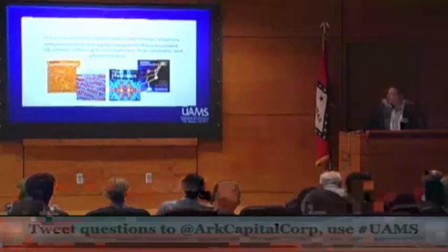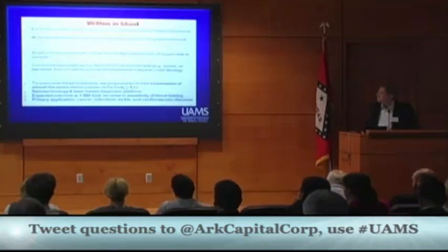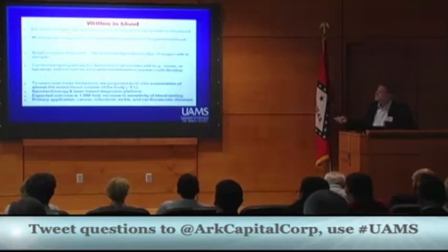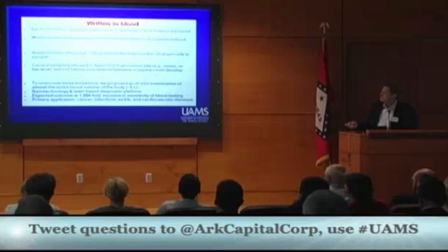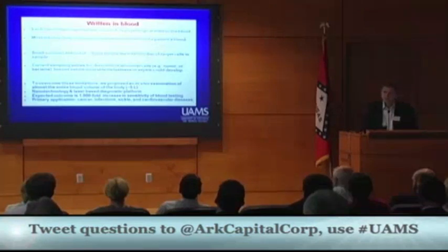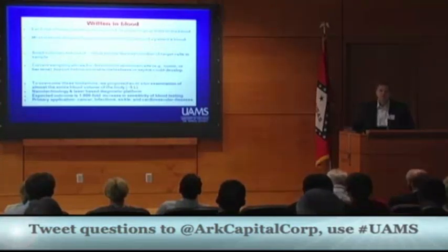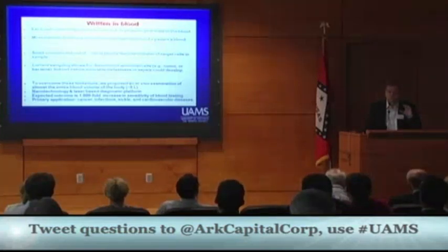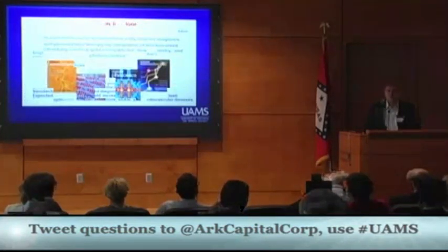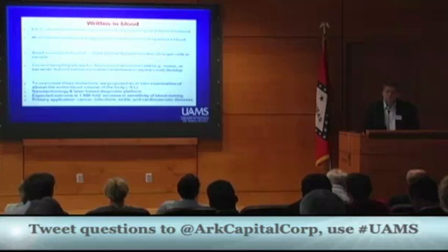We suggested several approaches with broad application. Today, I will focus on a few of them. Just again, why in vivo? Because with conventional approaches, it's just a few milliliters of blood. For rare diseases or rare abnormal cells, such as sickle cells, circulating tumor cells, bacteria, and viruses, you can miss them if the blood volume is very small. That's why, at 1 cell per 1 milliliter, and with approximately 5 liters of blood, we miss 5,000 cells if we sample a very small volume.